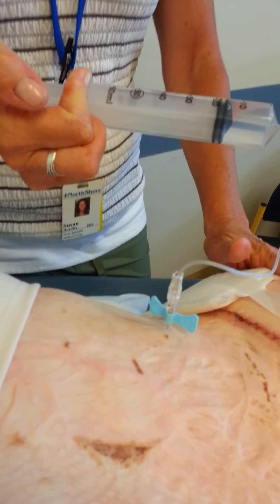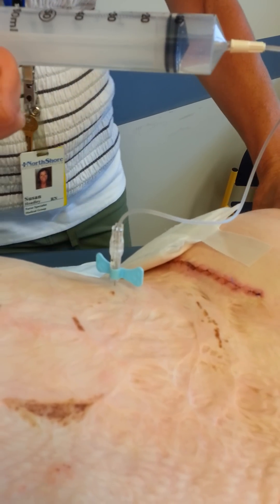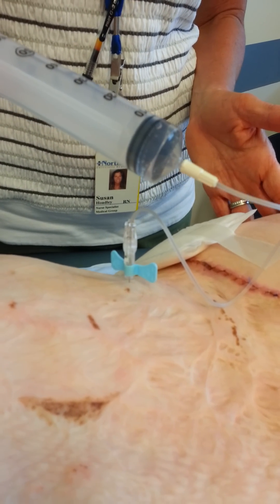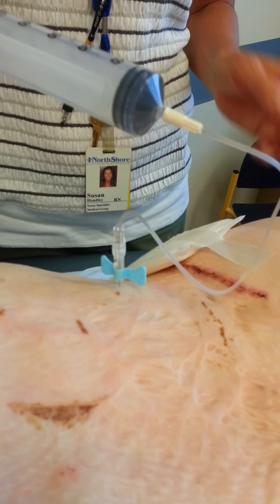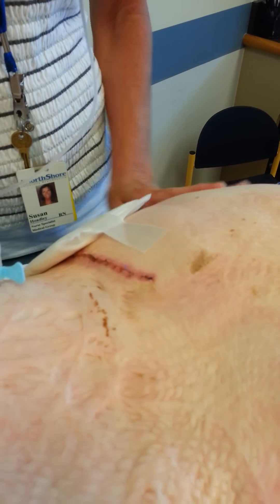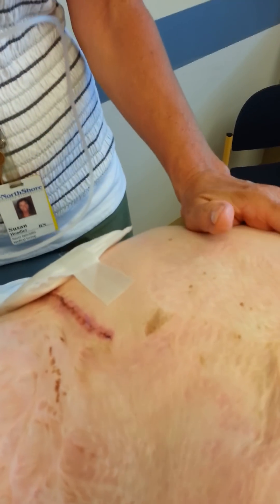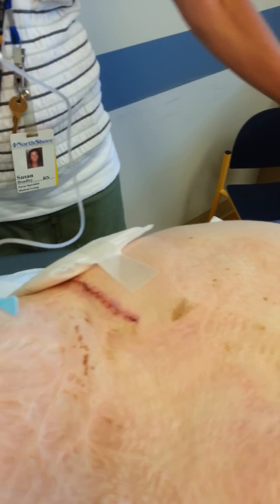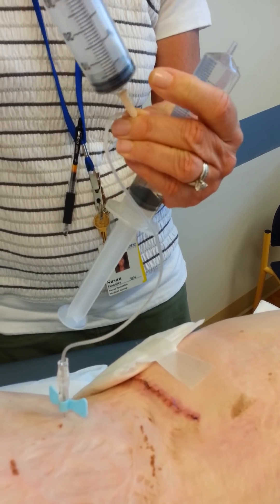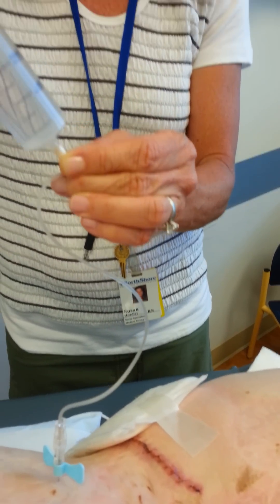So you've got to really keep that on your mind to be careful. Even though it's just early right now, it's something to keep in mind. She didn't draw any landmarks with how far down it went? There were purple markers down there, but I think I got them off. It wasn't below the cheek — it was kind of down further. So it really comes down your buttock — the whole expander. This syringe is empty. I have my other syringe ready. I'm going to just pinch this here, twist this off, and of course we don't want anything touching that tip. Put it down there and then just continue.